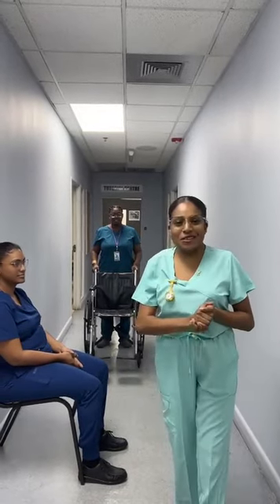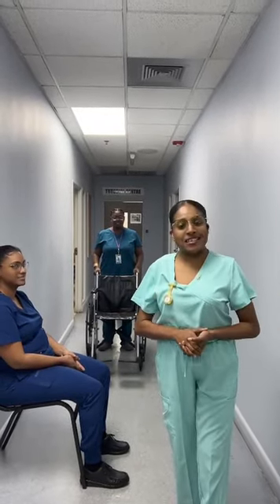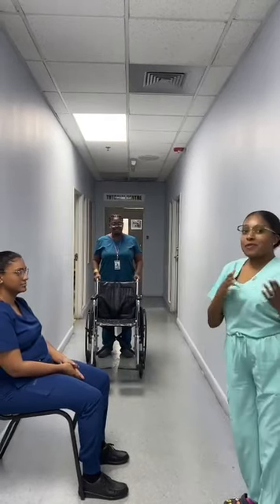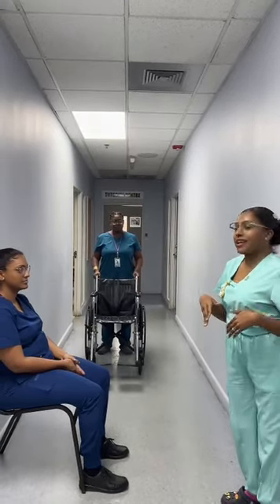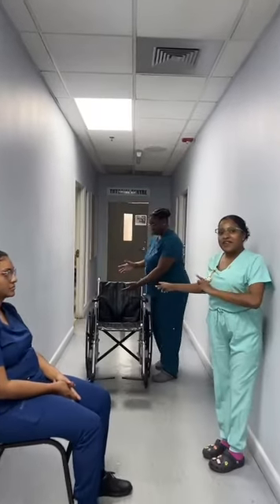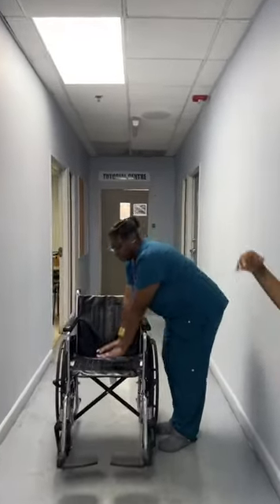Today I'm going to talk to you about using assistive devices. So today we're going to start with the wheelchair. Assisting a patient to ambulate using a wheelchair, we will need to ensure that our device is safe and ready to be used.